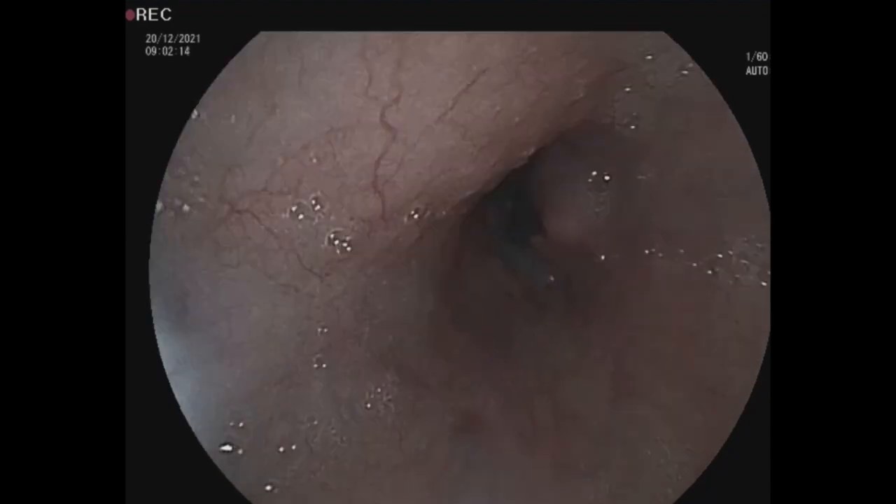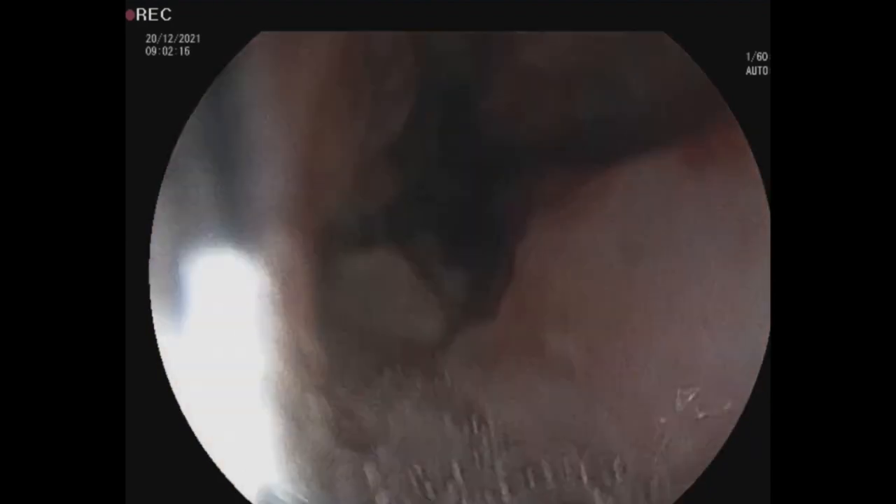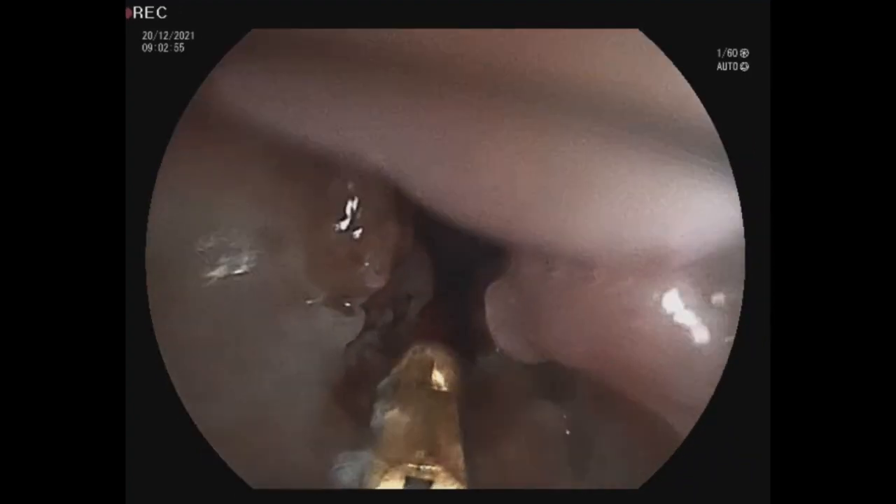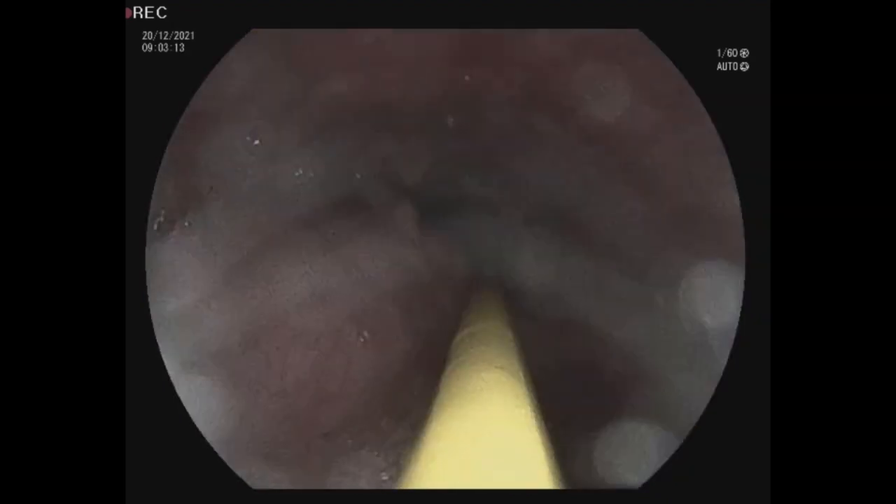This is endoscopic video of a 77-year-old male with esophageal cancer. This man refused surgical treatment of the cancer, and we decided to make a percutaneous endoscopic gastrostomy as a nutritional solution for dysphagia.